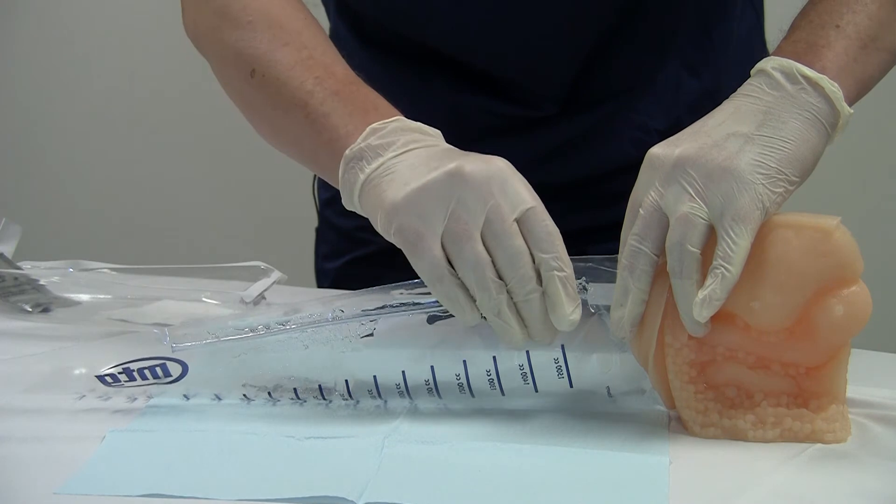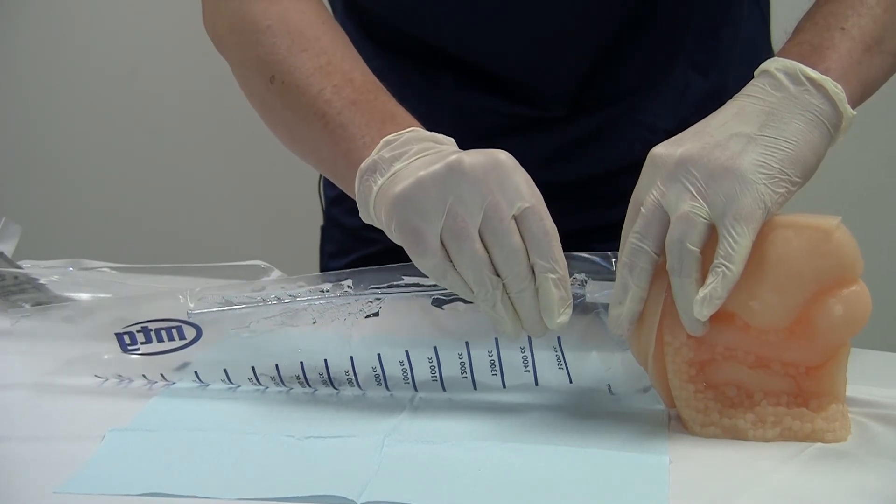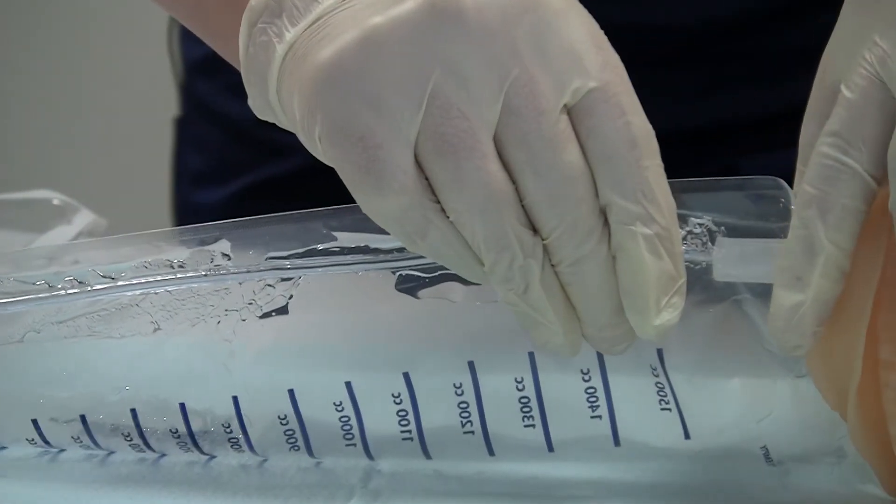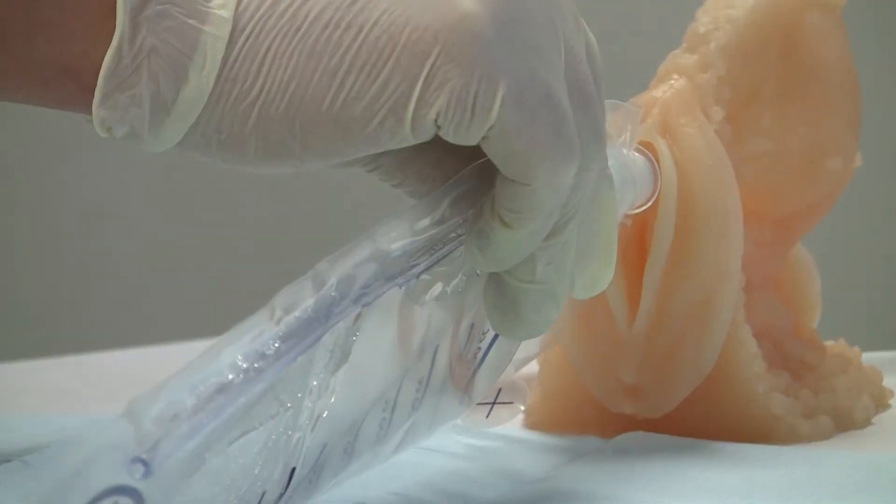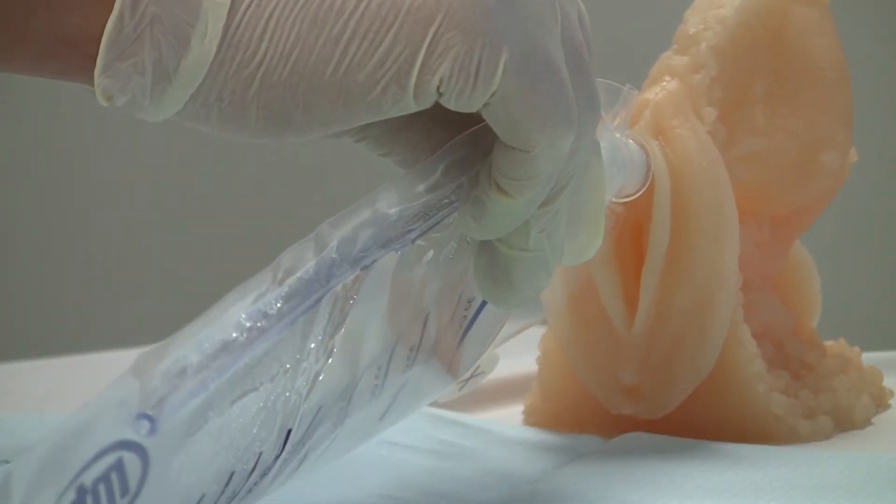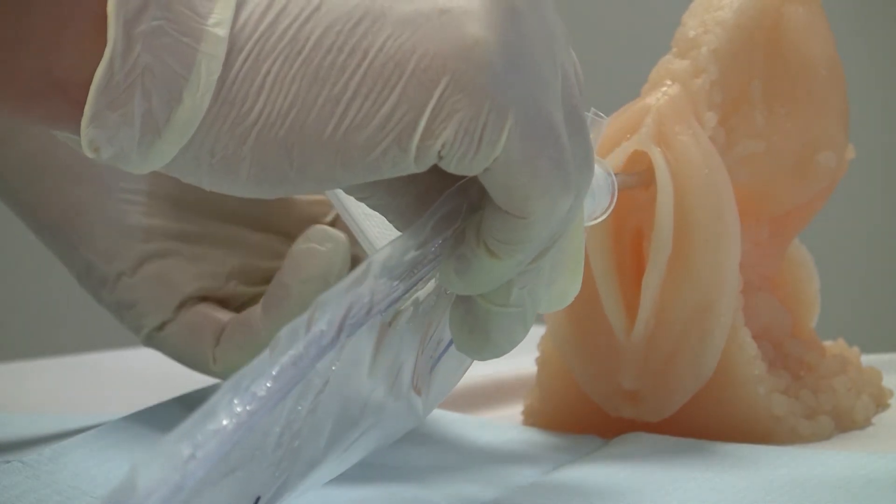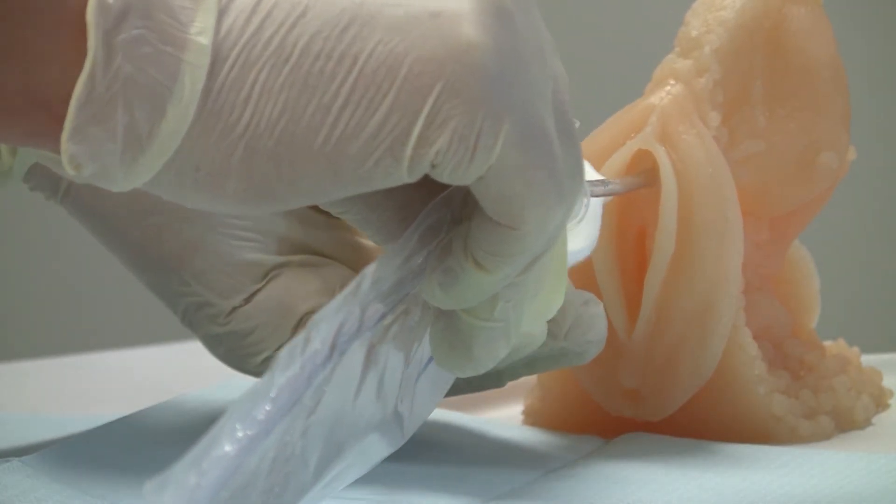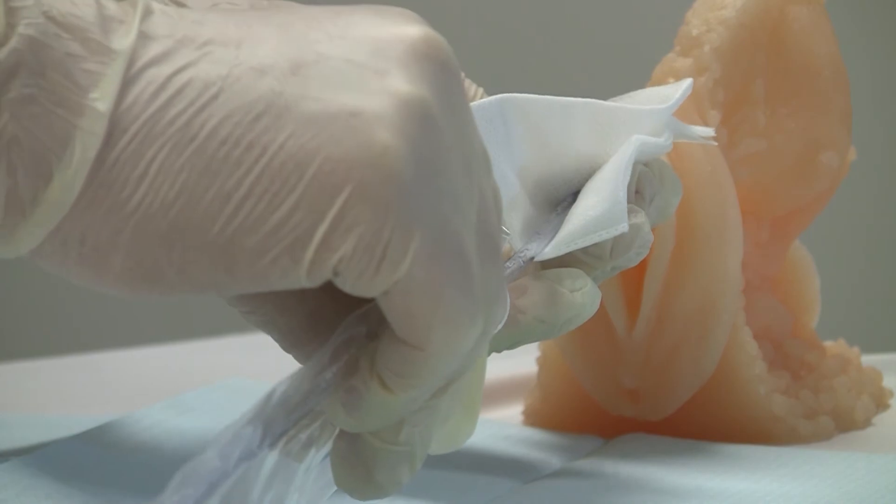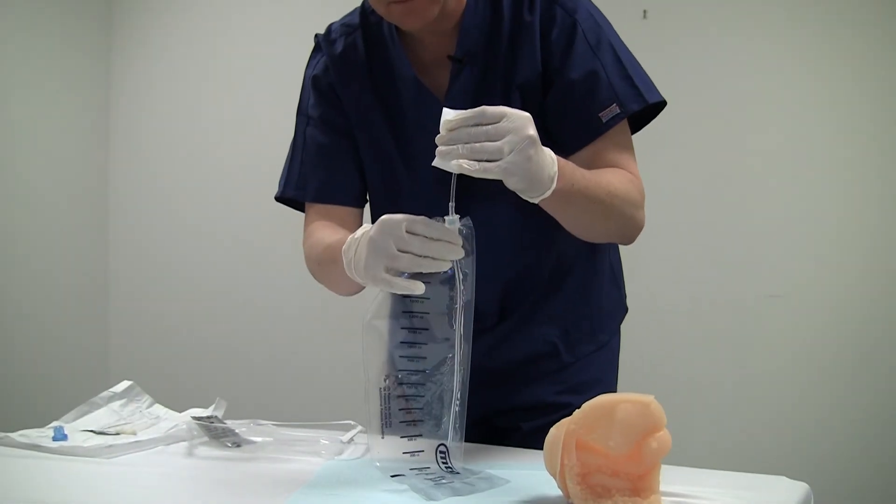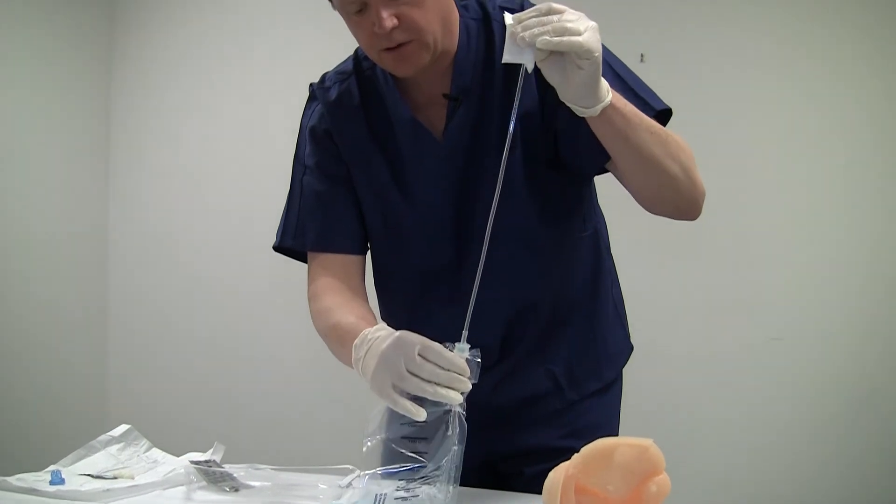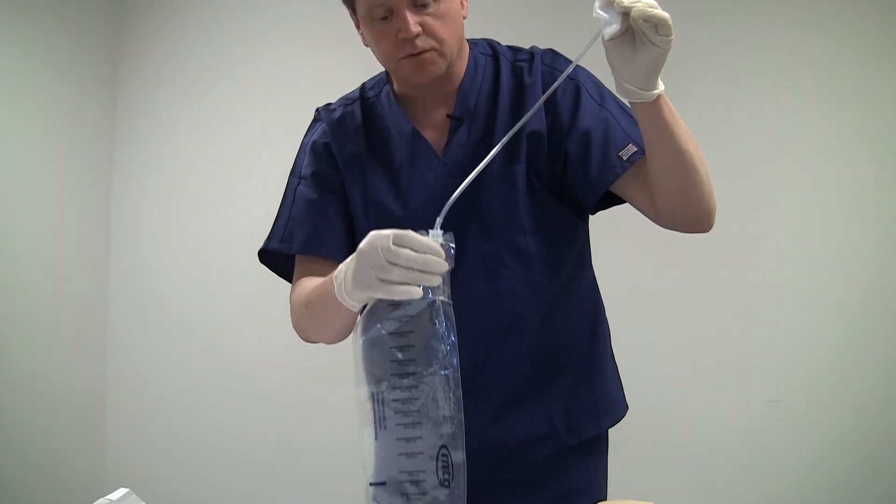Once she discontinues voiding, hold the catheter just like we did in the male example and pull the catheter out about one inch and see if we have any more fluid. Reach back into the kit and get that gauze tissue. As the catheter leaves the body, use that gauze tissue to catch the eyes so we don't have any spilling. Clamp the eyes off. Extend the catheter all the way to the end. Measure and record output.